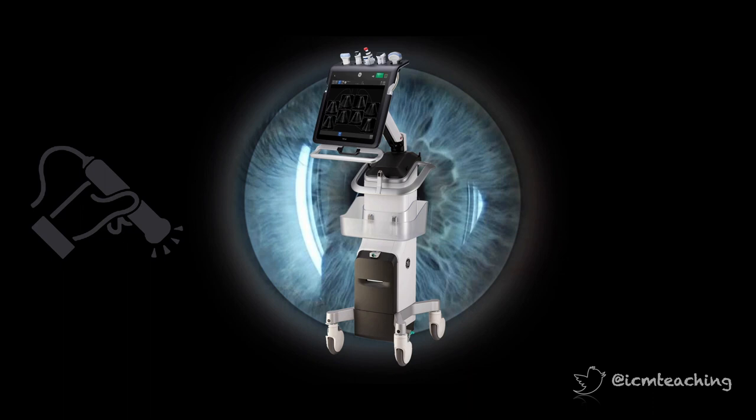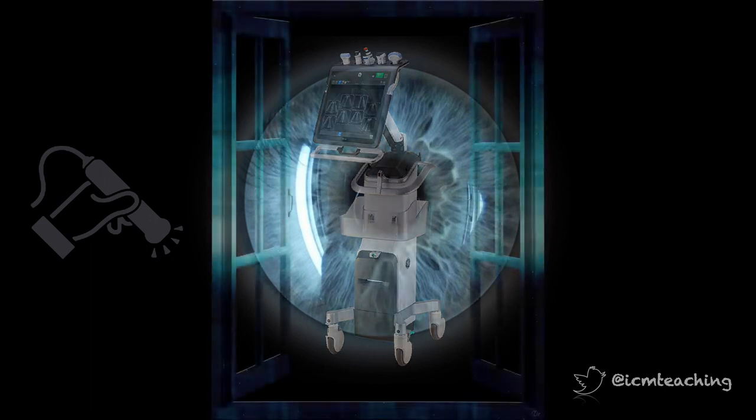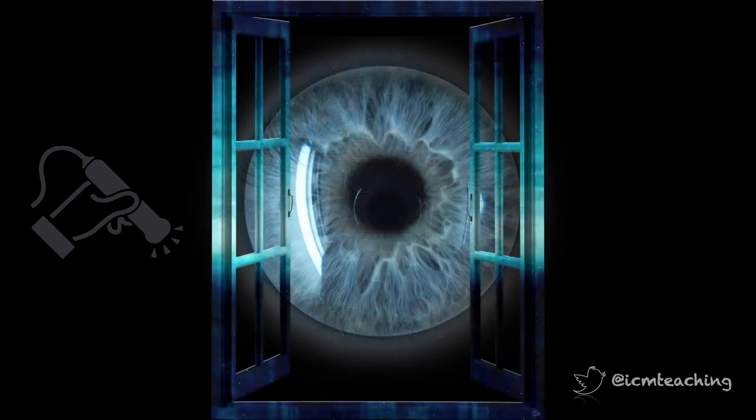Now, ultrasound of the optic nerve has been generating a lot of interest in recent years. Ultrasound gives us a window into the brain, whether it be transcranial Doppler or optic nerve assessment. The idea of having a non-invasive imaging tool you can use at the bedside to help decide if someone has raised intracranial pressure is very attractive.